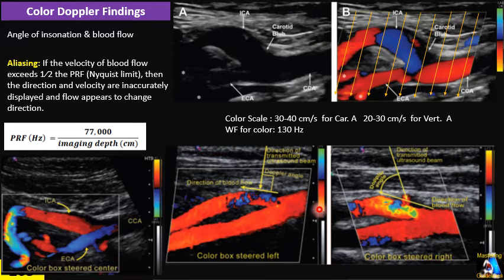Here you can see. So in the aliasing, we have a color change from those two extremes. Meaning here, for example, bright yellow and green at this level. So it has a combination of the yellow and greenish, not the dark area close to the zero. So we have a bright color map at that level, and it tells us there is high velocity at that spot, or we call it a jet.